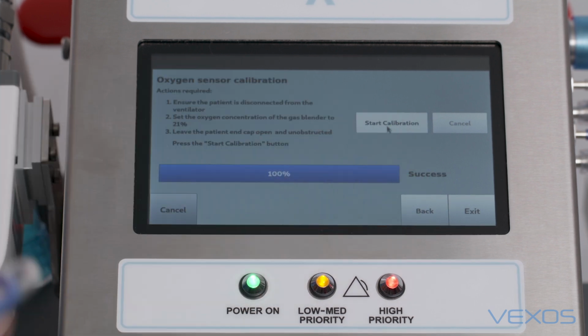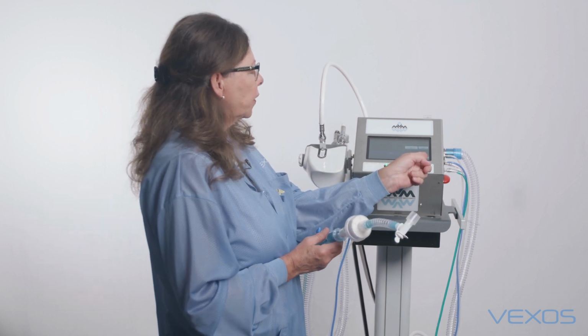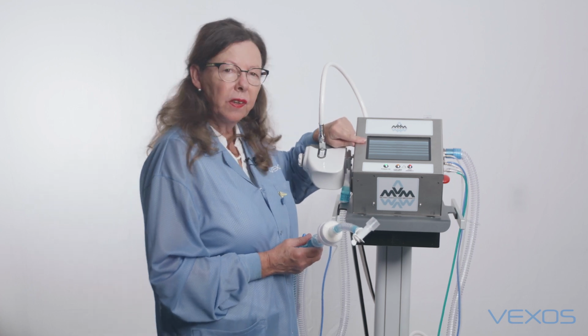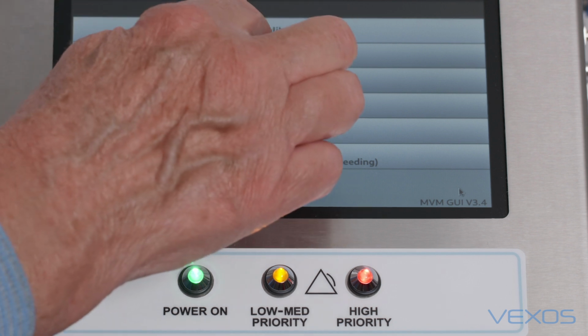100% completed, the test was successful. On to the next test by pressing exit. The next test is the self-test. The self-test consists of 4 other tests.